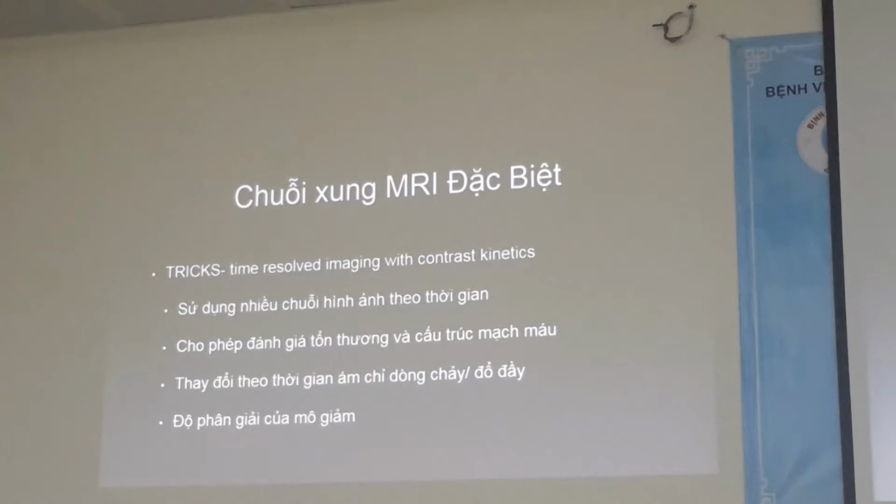And for us as ophthalmologists, we are usually interested in looking at orbital vascular abnormalities, but there can be vascular abnormalities in the face or even vascular abnormalities in the brain that can be evaluated with this type of imaging sequence.